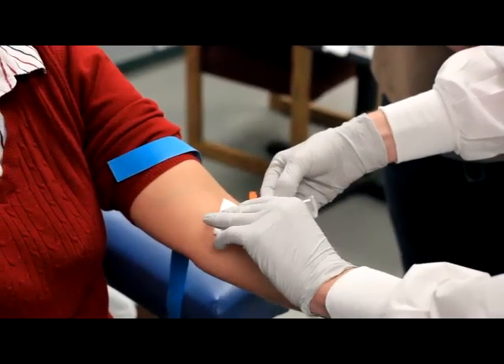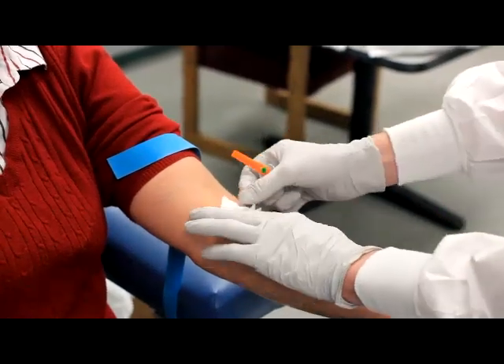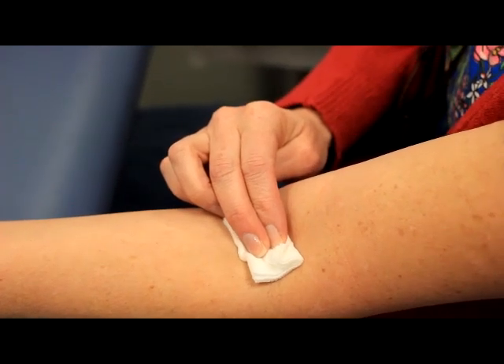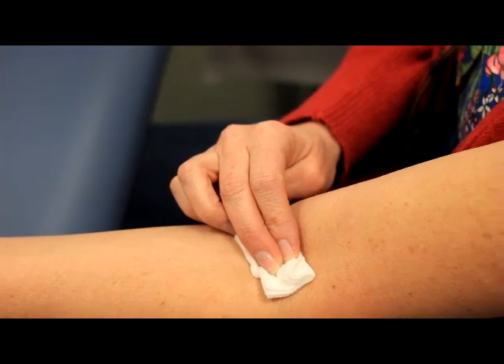After removing the tube from the holder, place your gauze over the needle, but do not apply pressure until after the needle has been removed from the patient's arm. If your patient is alert, you can have the patient hold pressure on the site. Pressure should be held for 60 seconds before checking for hemostasis.